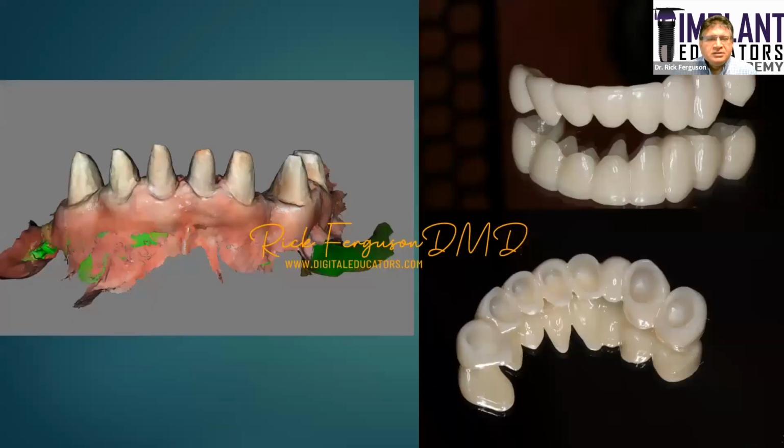Okay. So here's a case that I did just last week. We had a patient that came in and we prepped out the lower teeth, and I actually had temporaries designed ahead of time. And what we did was a Boolean subtraction from the pre-designed temporaries. While the patient was waiting, we printed these on the SprintRay printer. I think it took a total of about 40 minutes to print. And then we basically just wiped them clean.